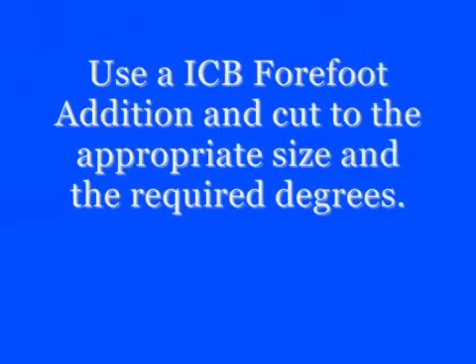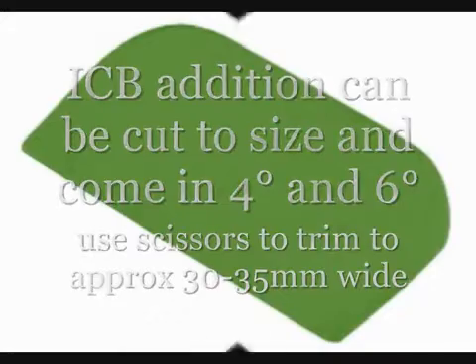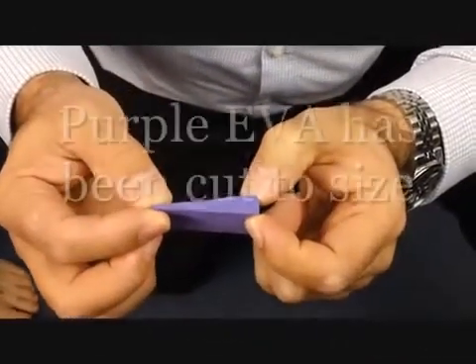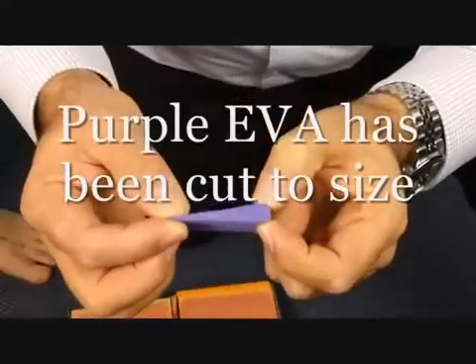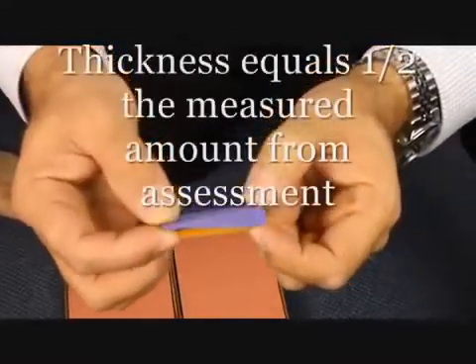To create a forefoot block for the foam box, use an ICB pre-made forefoot 4-degree or 6-degree addition and trim to size. The forefoot wedge or block can be used for both forefoot valgus and forefoot varus in the foam box cast.